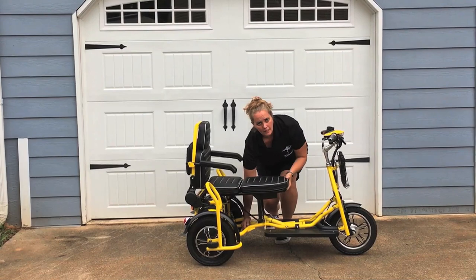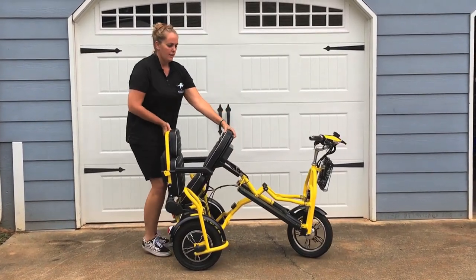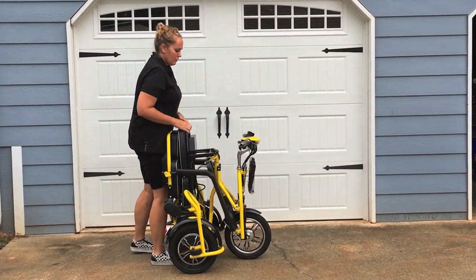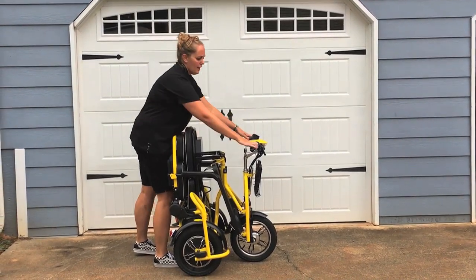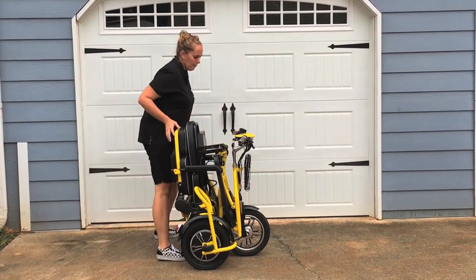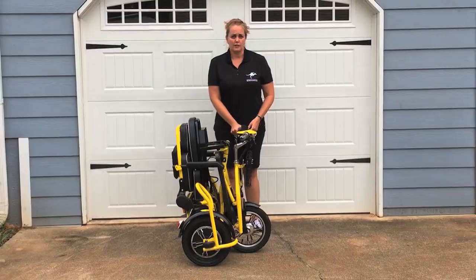To fold up the bike, you pull the pin, lift up on the seat, and pull the seat into your body. I find it easiest when you stand behind the flyer and pull everything into you. That's how to fold and unfold the Tricaroo Flyer XL.